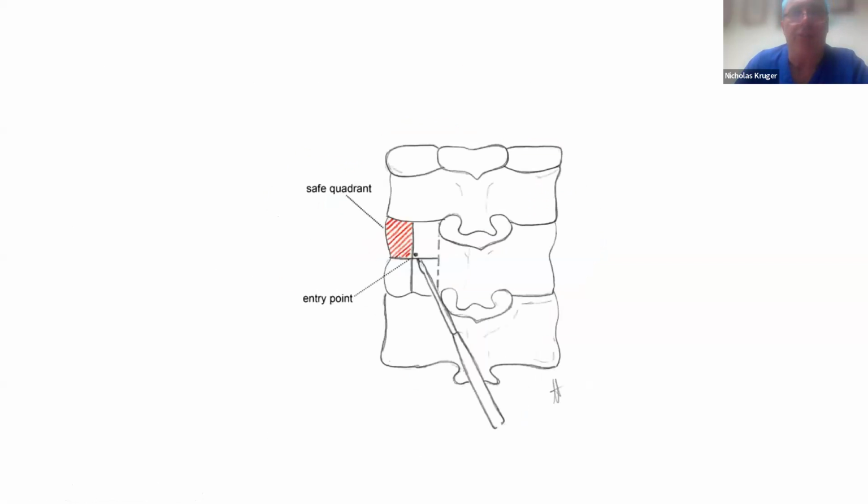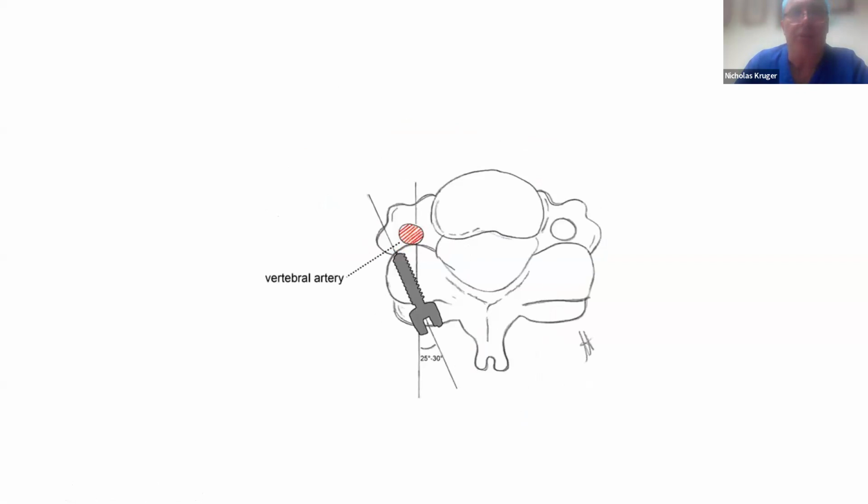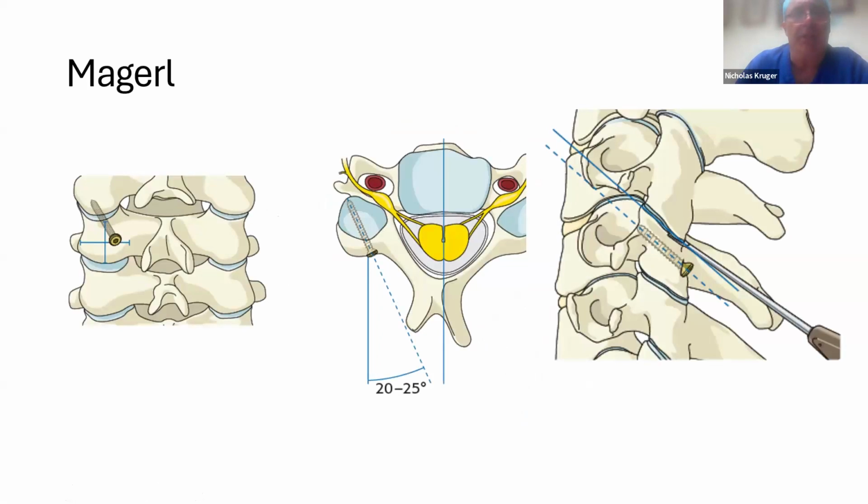So it'll be a typical lateral mass fixation. Put the screw in. It's not the best biting screw. They are, but you aren't biting really hard bone. But if you get lots of them, you get quite a good fix, and you fix them into the rod. So that's a technique. You can see we're going laterally to avoid the VA and the nerve root.